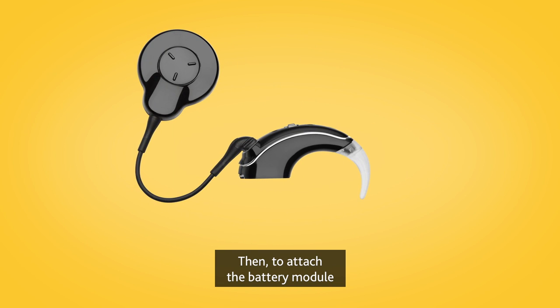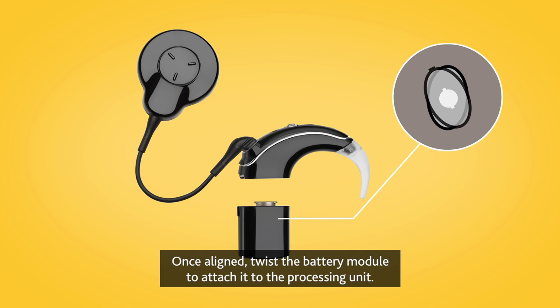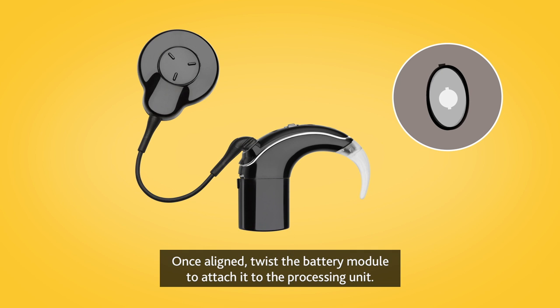To attach the battery module, hold it at a slight angle to the sound processor socket. Once aligned, twist the battery module to attach it to the processing unit.